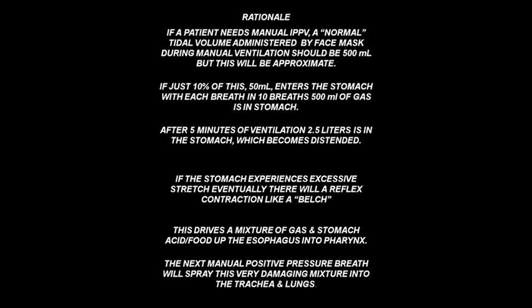As we ventilate, the possibility and the probability of gastric insufflation, gastric acid reflux, and pulmonary aspiration increases. So, as soon as the patient has been treated for their hypoxemia and they are pink, it is time to attempt endotracheal intubation to protect the patient's lungs from aspiration of gastric acid.